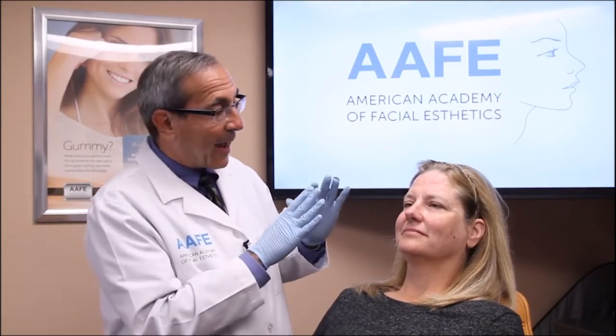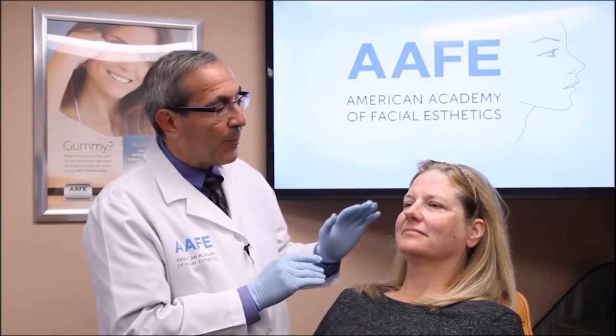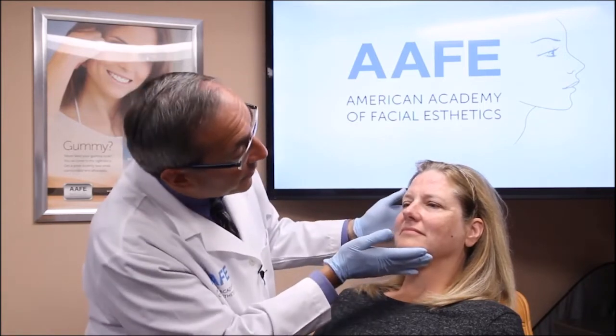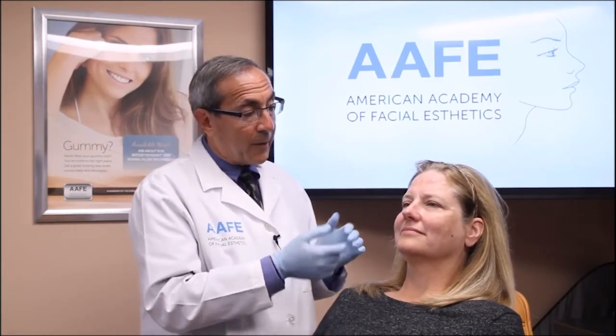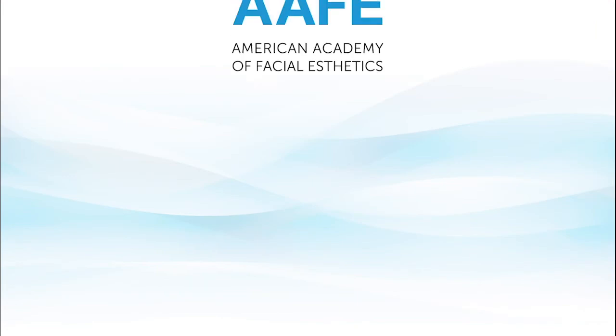You did great — you're a really great patient. Don't touch your face. If you're going to put on makeup, use light makeup and try to use newer makeup because old makeup has a lot of stuff in it that we don't want getting into fresh injection sites. That's it for botulinum toxin — we'll get your after pictures and see how you did.